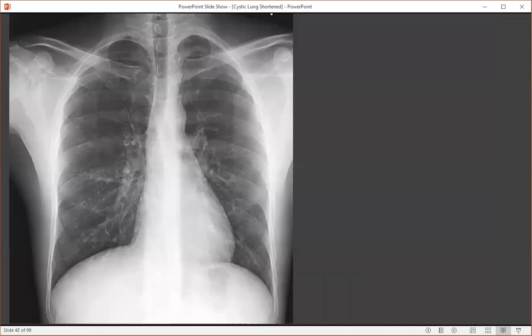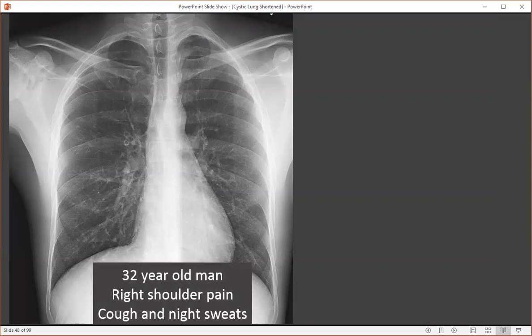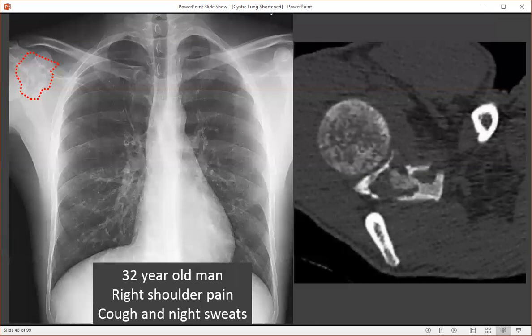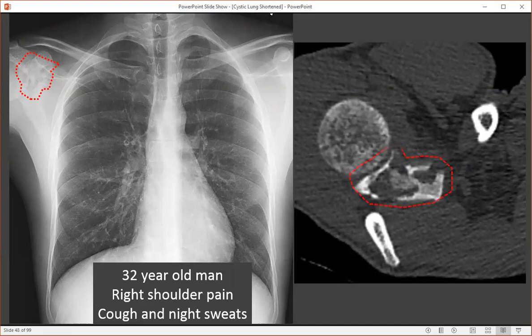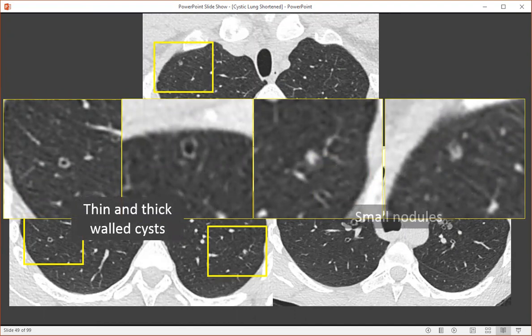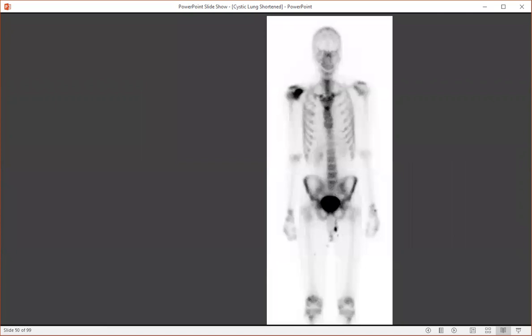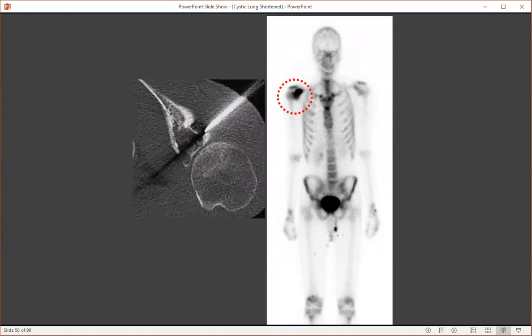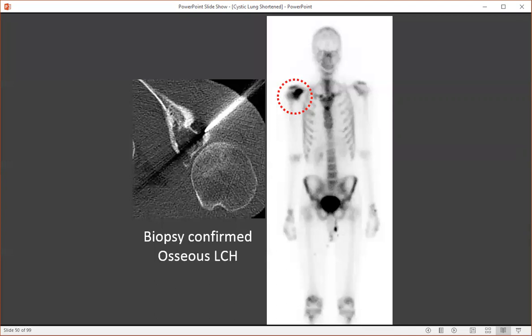Here's another case — a 32-year-old man with right shoulder pain, cough, and night sweats. This prompted the radiologist to look at the right shoulder, and there was a lytic destructive lesion. A CT of the right shoulder showed an aggressive appearing lesion within the right scapula, initially thought to be a primary malignancy of the bone or an aggressive infection. The chest CT showed thin and thick-walled cysts, solid and subsolid nodules in the upper lung zones — this could be confused with metastatic disease. However, this was a smoker and these findings are characteristic of pulmonary Langerhans cell histiocytosis. A bone scan showed just that single lesion in the right scapula, and biopsy confirmed osseous Langerhans cell histiocytosis, which complicates about 10% to 15% of adult cases.